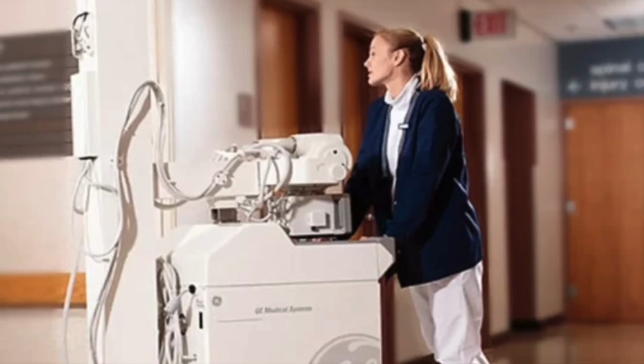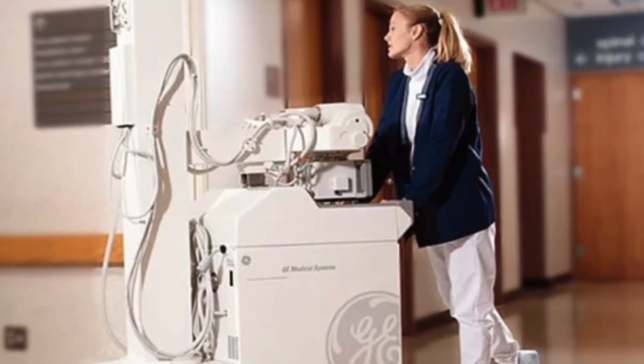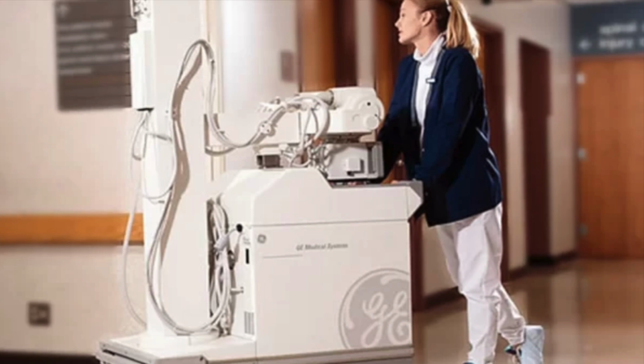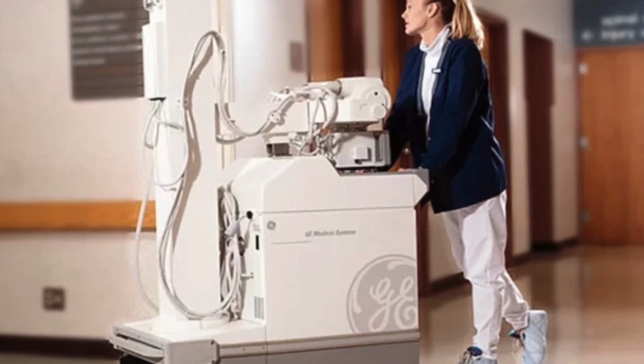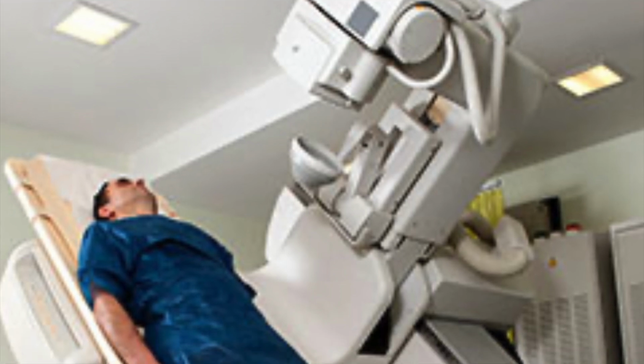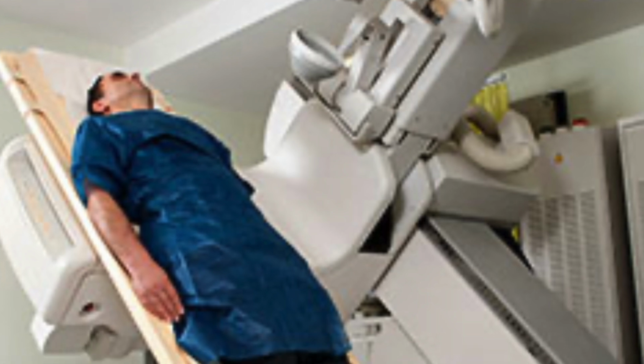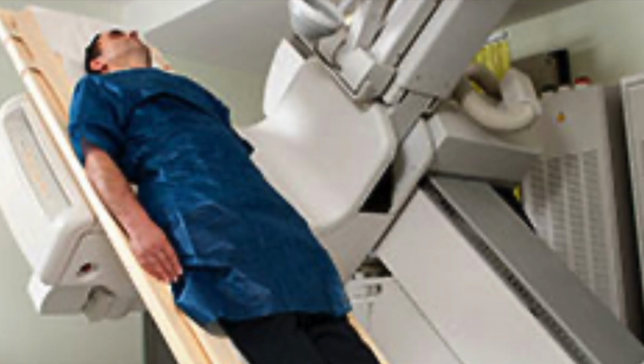There is portable X-ray machine. So this is a compact machine that allows, again, for bedside imaging. This is commonly used in emergency settings or for patients that are unable to move. And then there's fluoroscopy, which is a type of X-ray that provides real-time moving images of the interior of the body, and this is often used to observe the digestive tract.